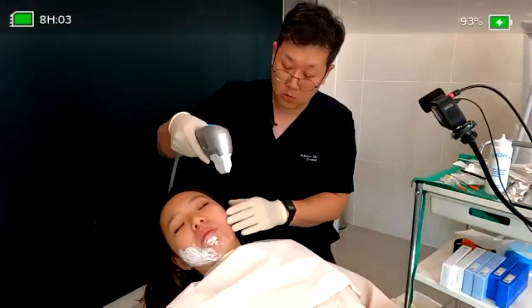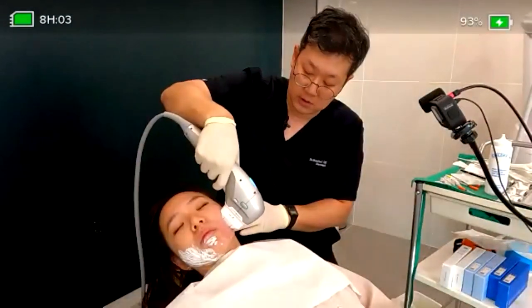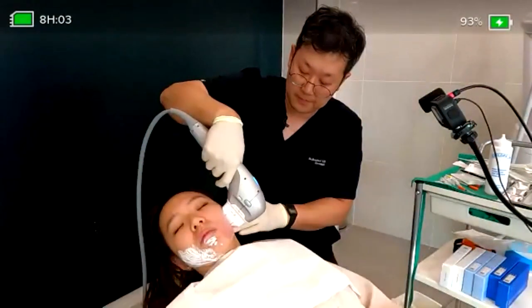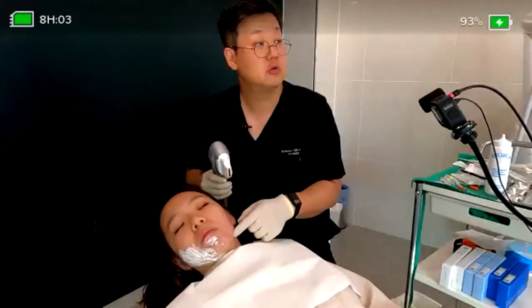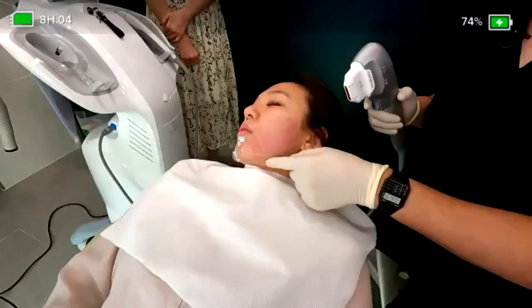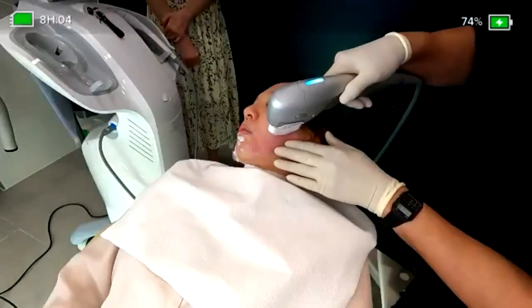And also, we are going to move on here to the focus range of the mandible contours. Maybe your patient can be doing here or here or here. So whichever part of the mandible has dual lines, it is one of the focusing areas.